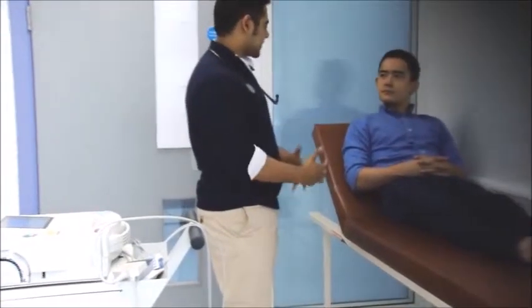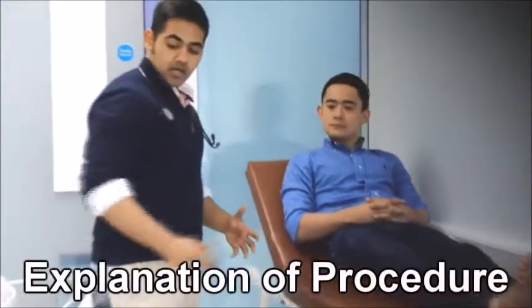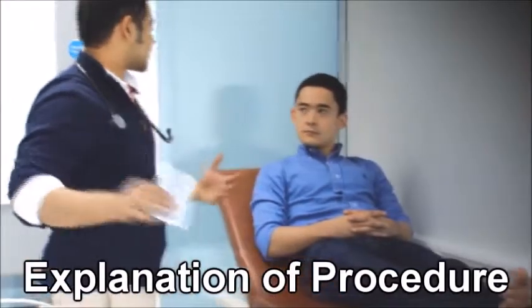Yeah, I think I have. Okay, so I'm just going to quickly tell you a bit about what I'm going to do. I'm going to be measuring the electrical activity of your heart and see how it's working. And so I'm going to be attaching some of these sticky pads to various points in your chest. And then I'm going to be attaching some of these leads onto those pads as well. Procedure shouldn't take longer than 5 to 10 minutes and it won't hurt at all. So have you got anything you'd like to ask me? No, that seems fine. Okay.